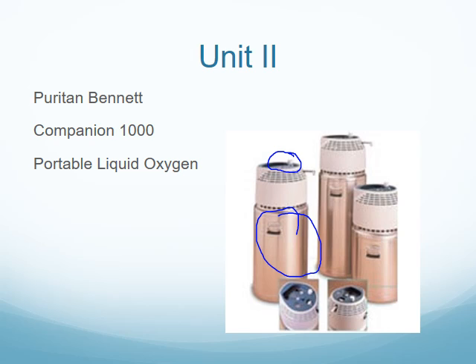If you're not using it for that reason, you can use it more as another type of oxygen source. It does have a little nozzle here that you can connect other devices to and use oxygen that way as well. I believe this down here is just a picture of the portable system. As you can see at the top of it, it looks like a puzzle piece, and that's what I would flip upside down and connect to my liquid oxygen system at the top here. Very interesting.